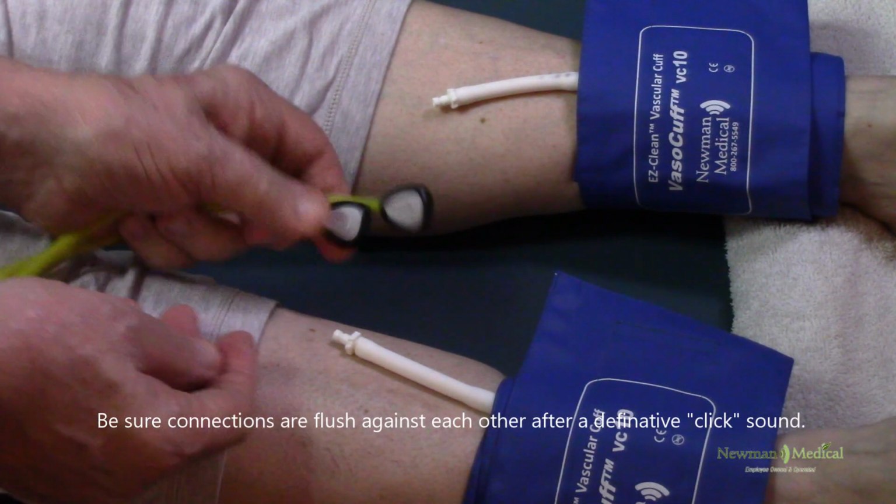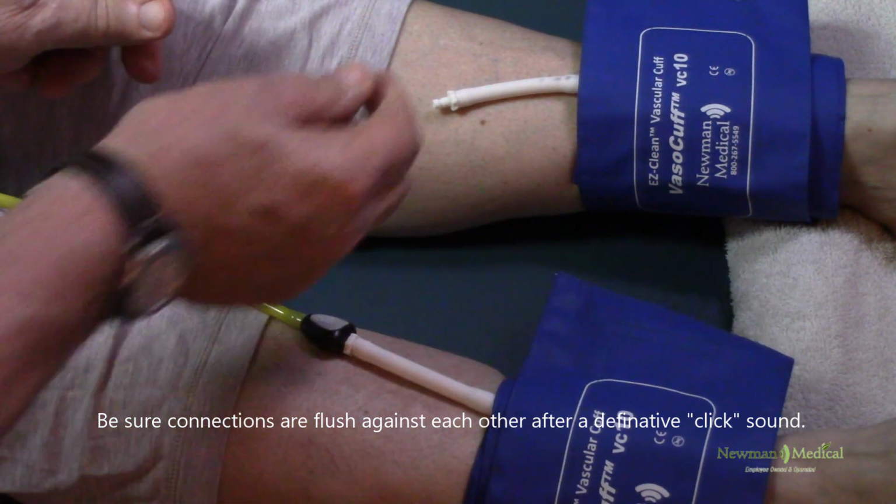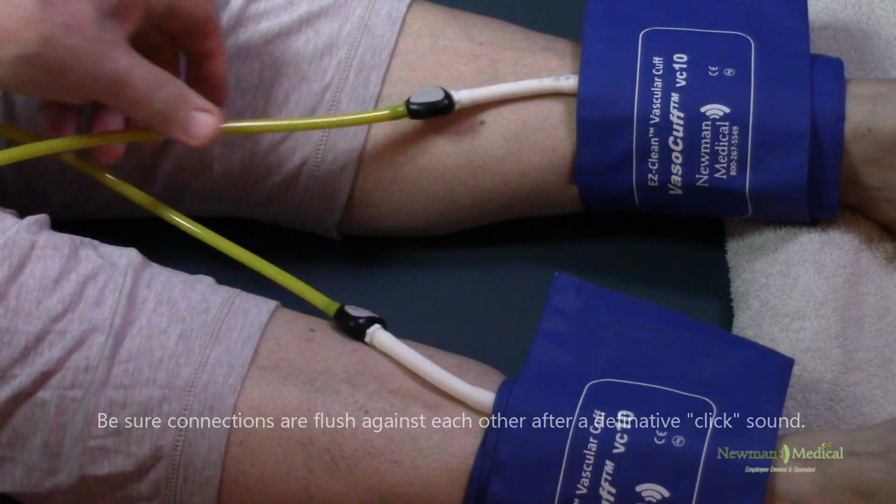Attach hoses from the Cuff-Link control unit to cuffs using the yellow hoses. The white connector goes to the patient's right side cuff and the blue connector to the left.